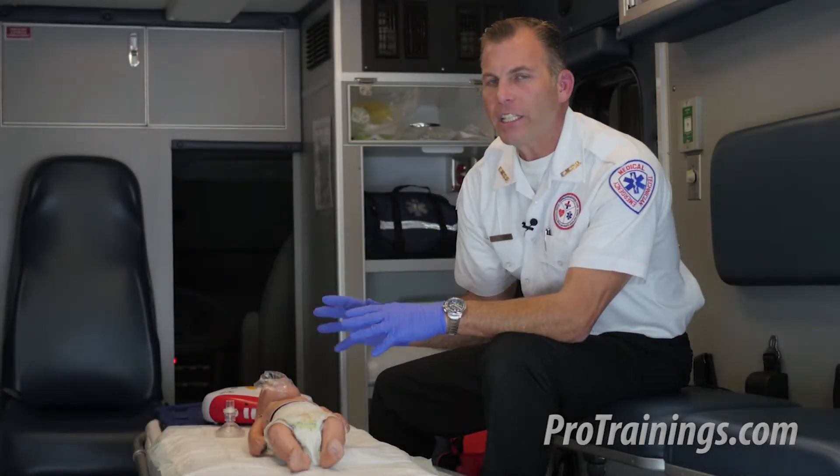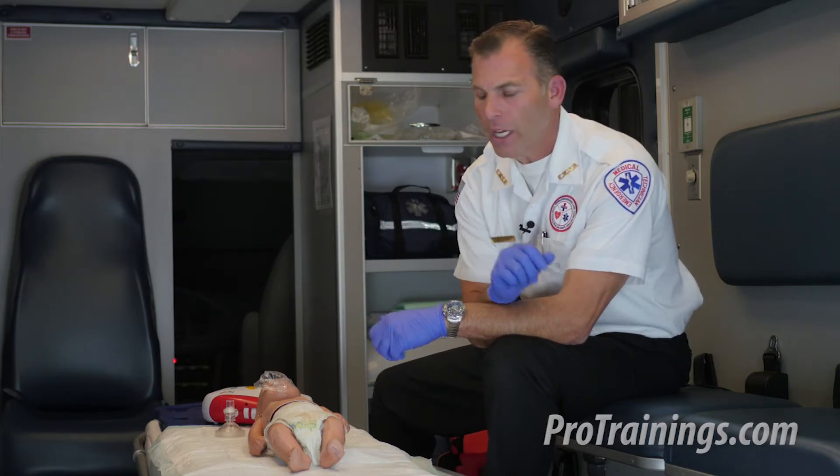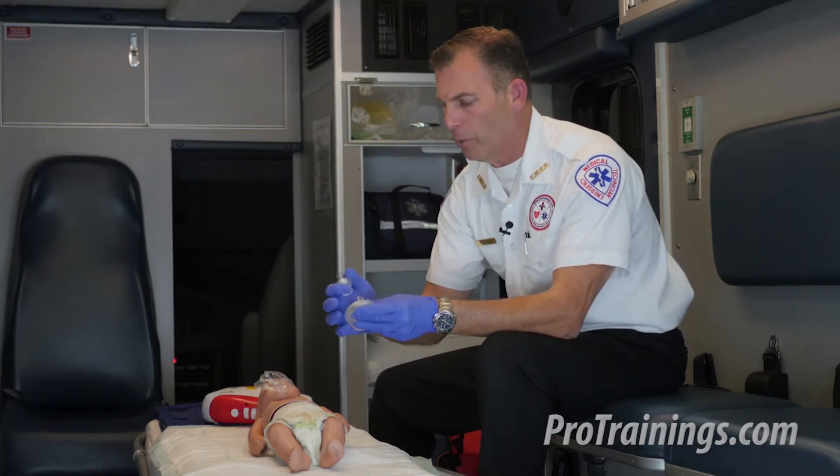Now let's cover the use of an AED on an infant for the health care professional for one rescuer. The scene has already been deemed safe, our gloves are on, and our rescue mask with the one-way valve is available.